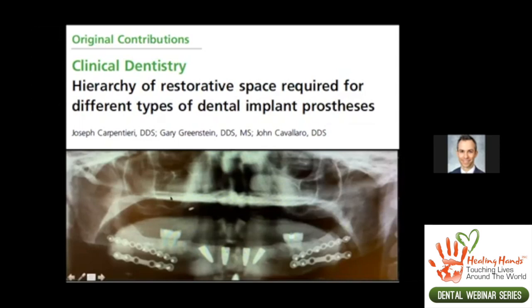This case here is a patient that had oligodontia and a very small mandible. It was very retrognathic. As a child, this patient had a brain tumor and required chemotherapy, and this chemotherapy caused agenesis of multiple teeth. And so I first advanced his mandible with a bilateral sagittal split osteotomy. It was a very large advancement, so I placed bone grafts and 2 long plates. And then I came back and we placed 4 implants in what's called the all-on-4 style with 2 distally angled implants.